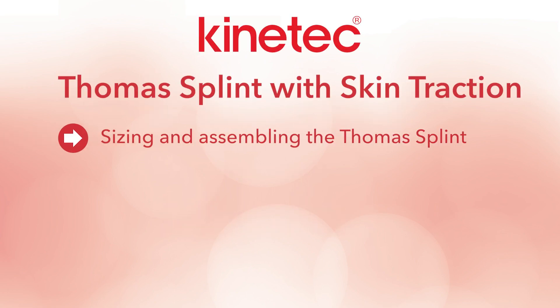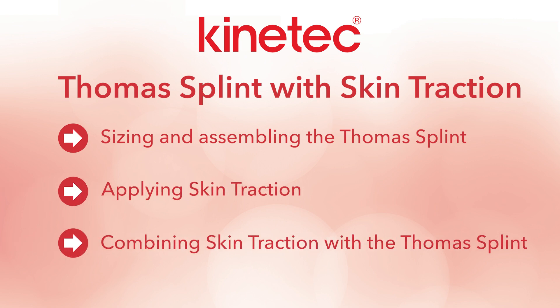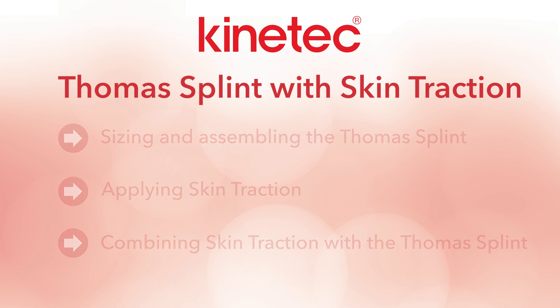In this tutorial we will guide you through the process of sizing and assembling a Thomas splint, applying skin traction and securing a patient in the splint.